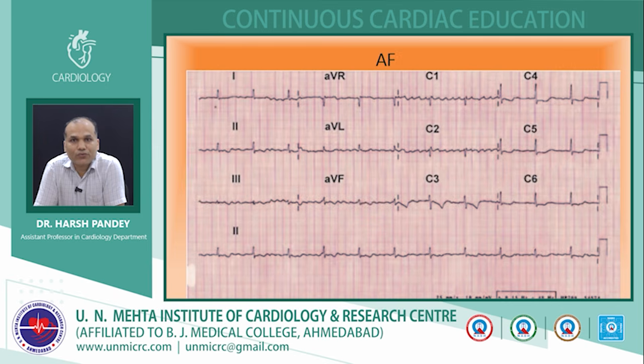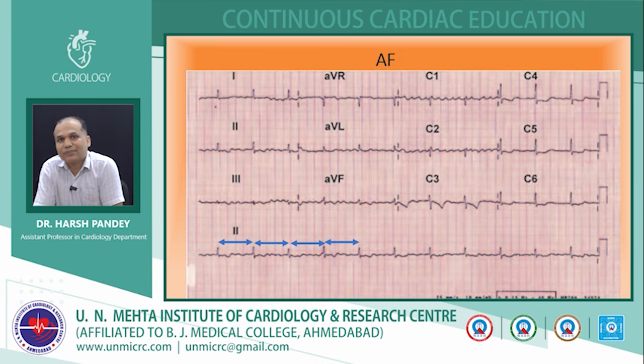So in case of AF, you have to recognize whether the patient has complete heart block or not. In atrial fibrillation, if you see the RR interval become regular, it is likely that the patient has complete heart block.